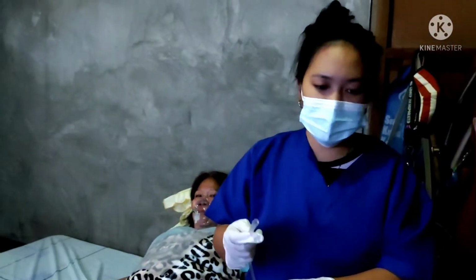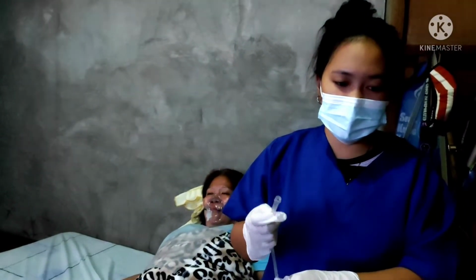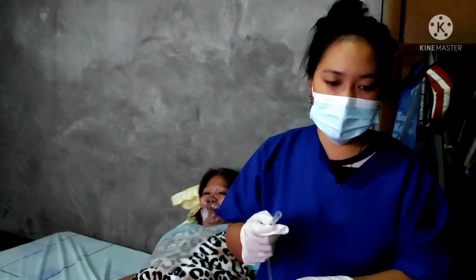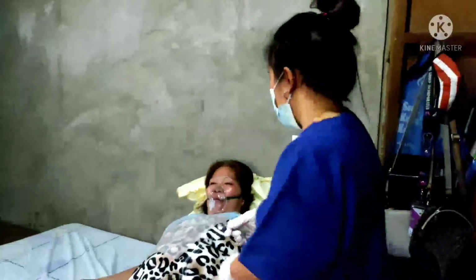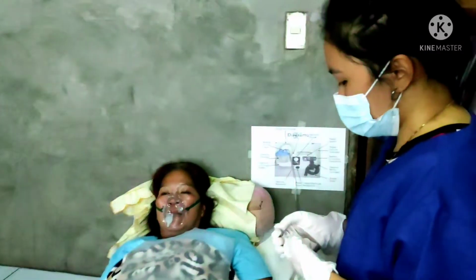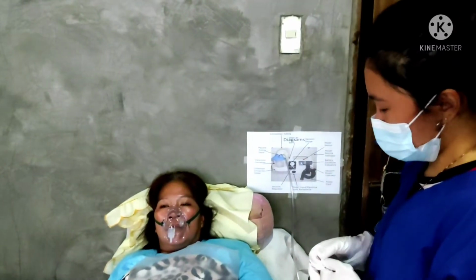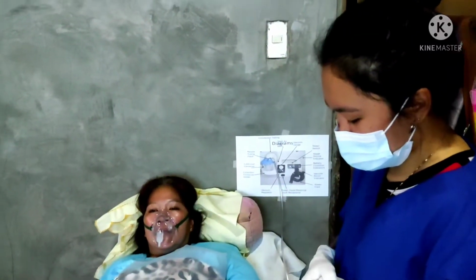Lightly coat 6 to 8 cm, or 2.4 to 3.2 inches, of the distal end of the catheter with the water-soluble lubricant. Miss Geraldine, I'm going to go ahead and suction down your nose into your lungs to help get out some of those secretions. Okay. Okay, thank you.